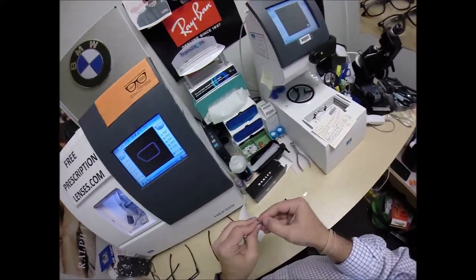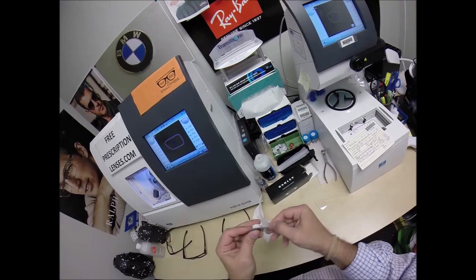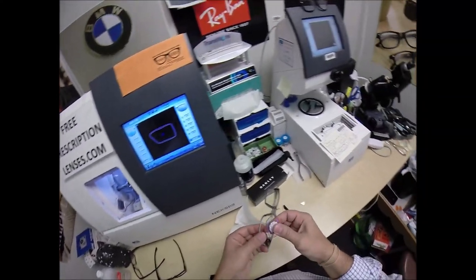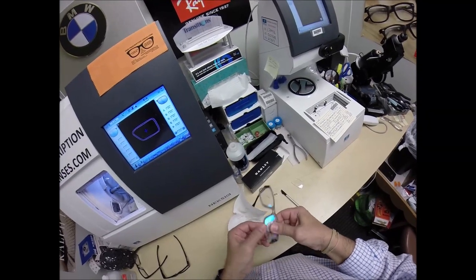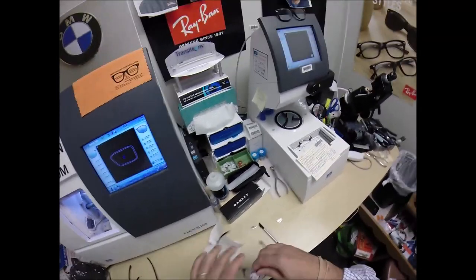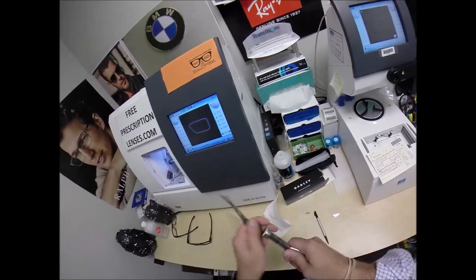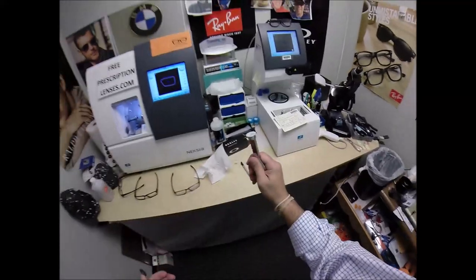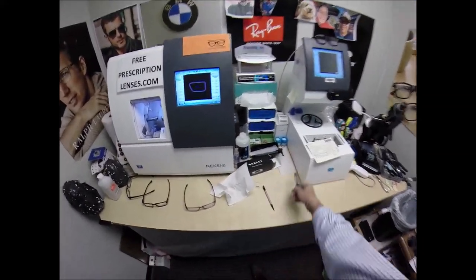So, clean everything off the lens. Oops, I saw a little piece there. Again, tuck the lens in the outside corner, push down the nose. Now it snaps in there easily. Pop that off, pull the sticker off, use my hand-approved drawing method, go for a three-point shot. Oh, and he makes it.